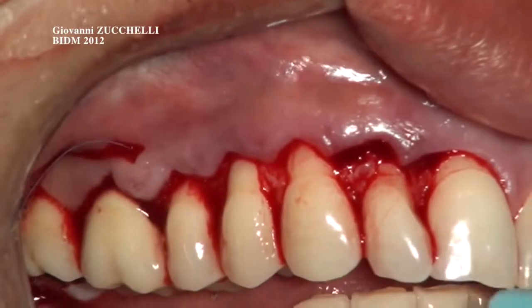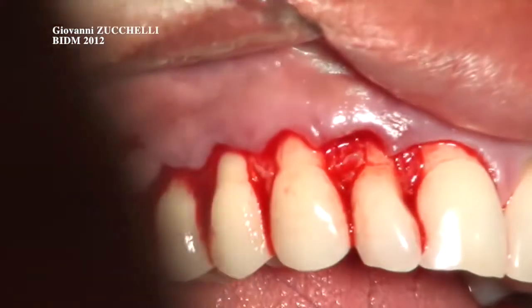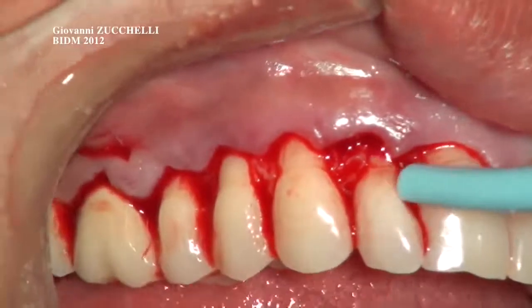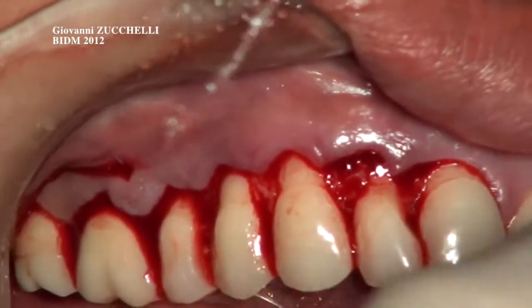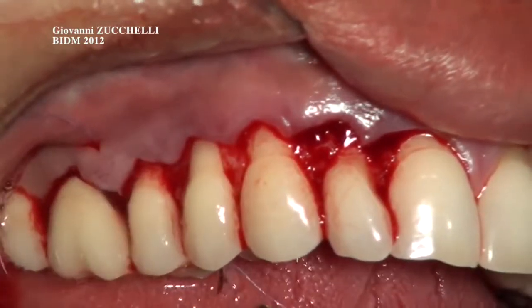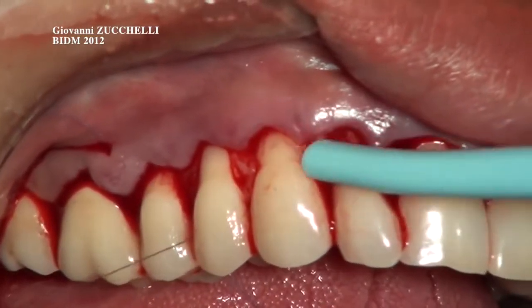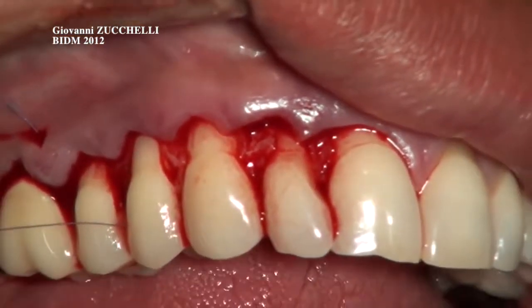Surgical and anatomic papilla reach the palatal aspect, open a bit, the suture material is turned around the palatal cingulum and is brought back, open please, below the contact point without perforating at all from the palatal aspect.